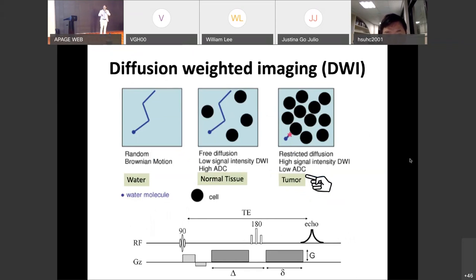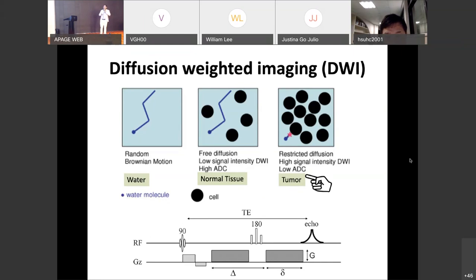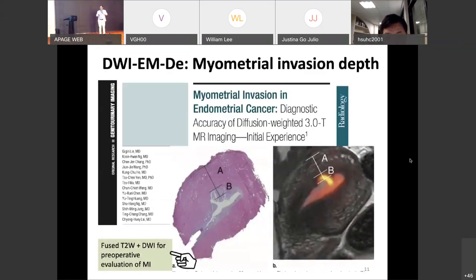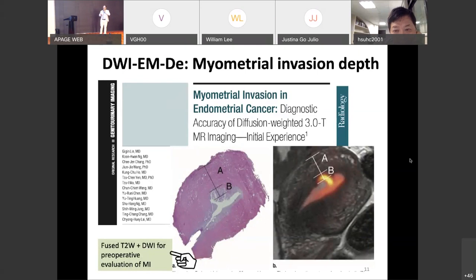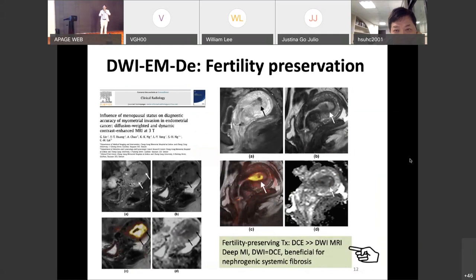Recently, using MRI theory but applying pulses for focusing and refocusing, we can measure the random motion of water molecules — this is called diffusion weighted imaging (DWI). For normal tissue, water molecules can freely diffuse through the tissue; however, in tumor and cancer cells, because cellularity has increased, diffusion of water molecules is limited. Using DWI, we can highlight the tumor structure. The highlighted signal on the sagittal image is generated by diffusion weighted imaging, and because it is acquired simultaneously with standard anatomical MRI, we find it very useful for evaluating myometrial invasion depth.